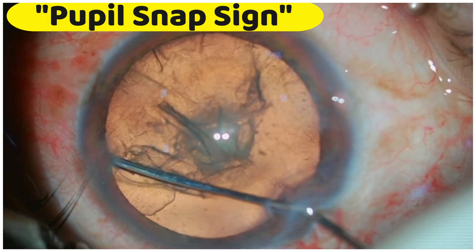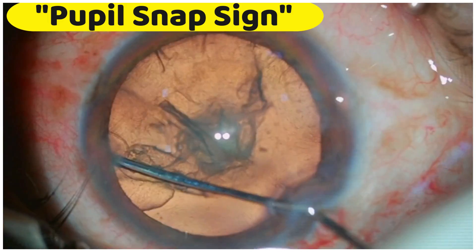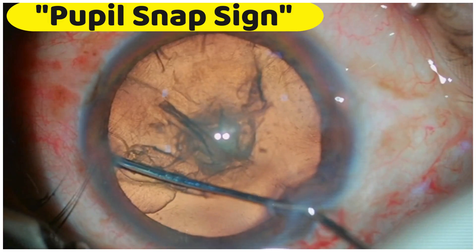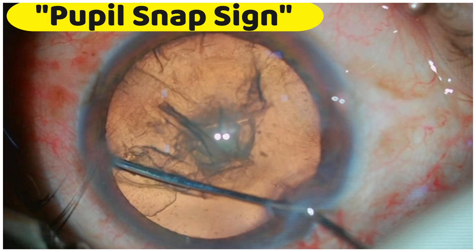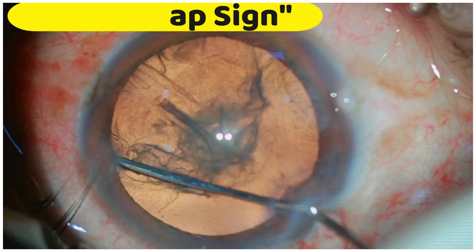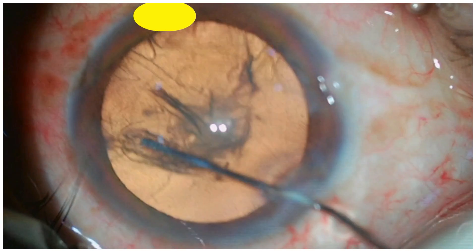Just watch this Pupil Snap Sign again and again. Watch how the AC deepens first and then the pupil constricts.